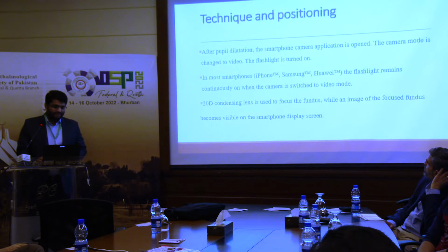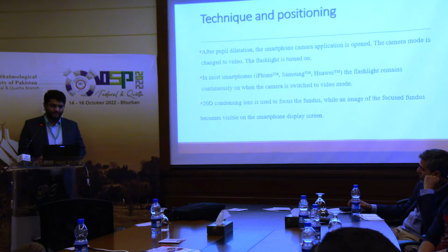I have tried it myself with iPhone, Huawei, Samsung, Vivo and Oppo phones, and it depends upon the location of the camera on the back side of the phone and the proximity of the flashlight to the lens of the camera. The 20D lens is similarly placed close to the eye of the patient, and the smartphone is used to take the photo.